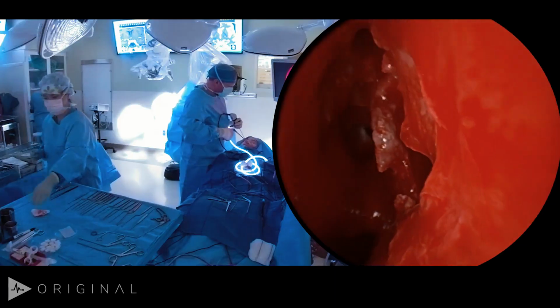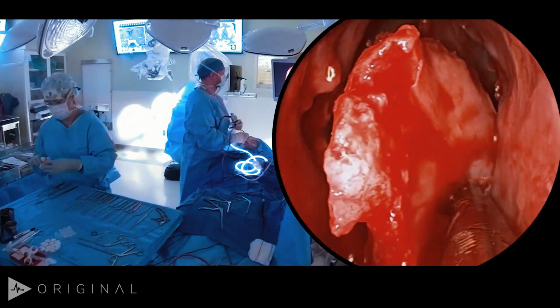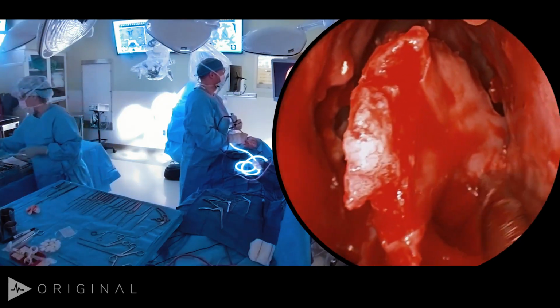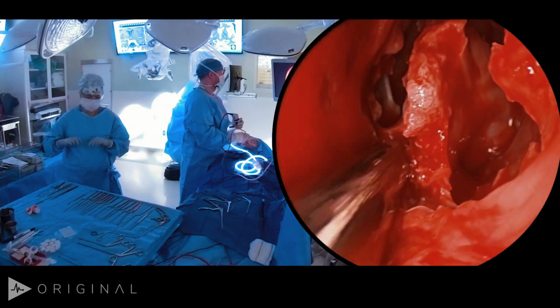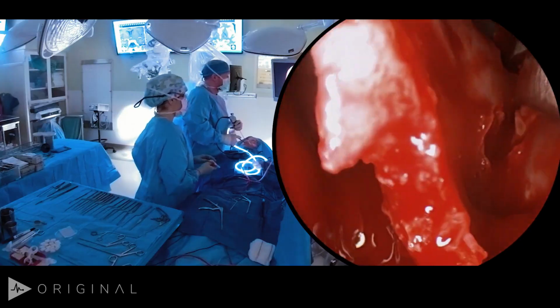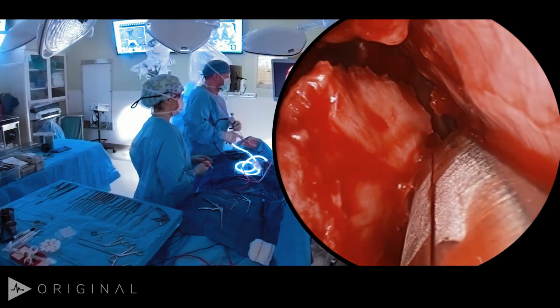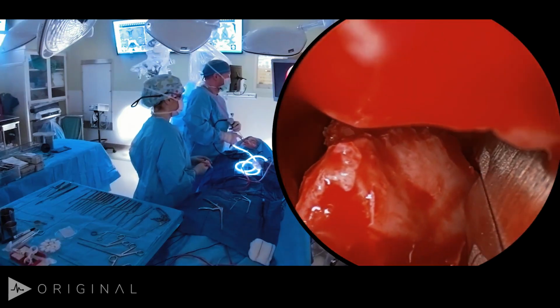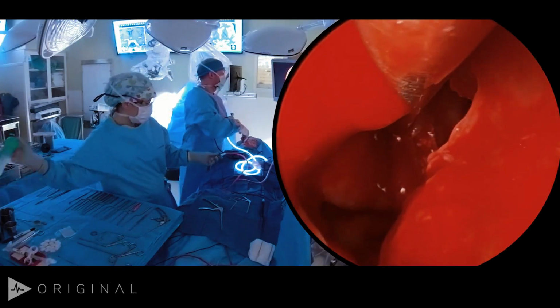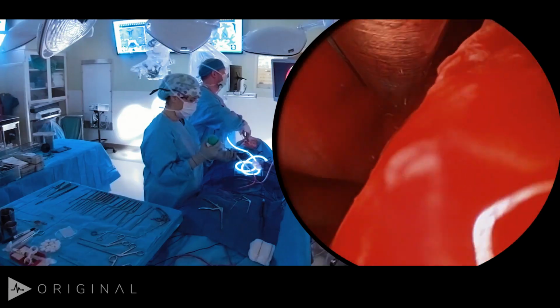So it looks like we got a pretty decent start. You can see we're pretty well freed up above the bone now, above the cartilage. So now we need to make cuts down here and down here so that we can get this piece in the middle out. And then again, you just want to be careful you're not grabbing any of your mucosal flap on this side. You want to engage it within the sphenoid sinus and kind of pull back a little bit. And same thing on this side. Don't grab your nasal septal flap.